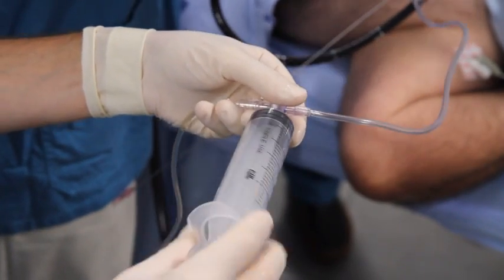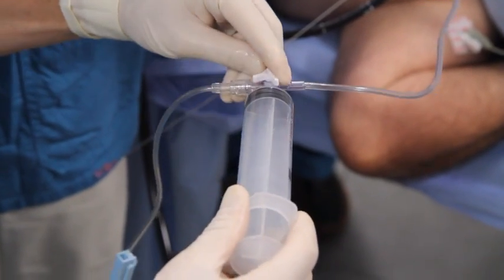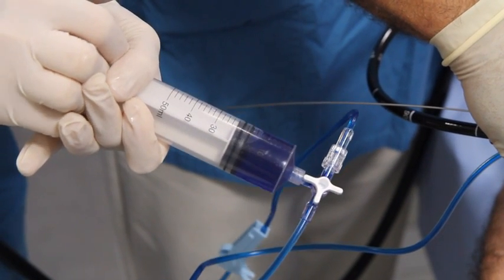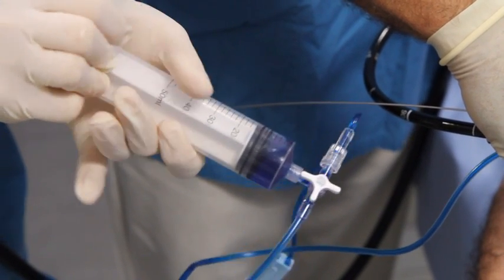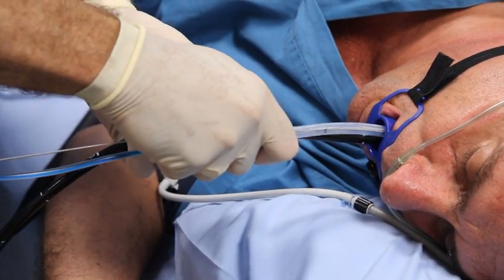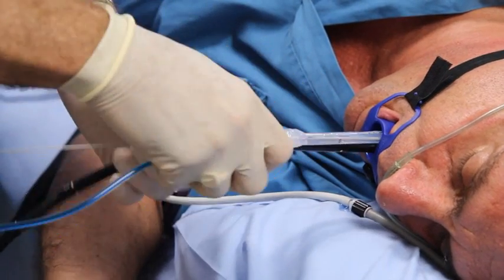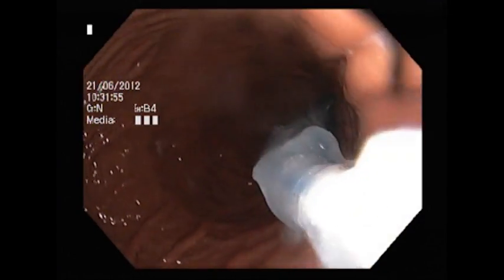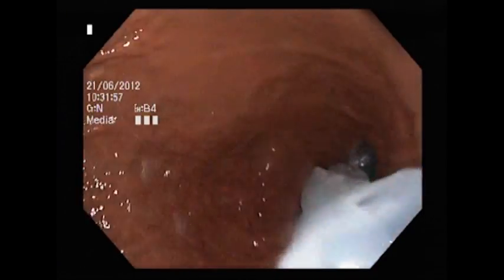Attach the three-way stopcock to the saline bag and the syringe. Inject 30 cc's of fluid to help release the balloon tip from the facilitator. Secure the endoscope with your left hand while pushing the pusher forward 5 to 10 centimeters with your right hand. This will release the balloon tip from the facilitator. Pull the endoscope back to confirm release of the balloon tip.